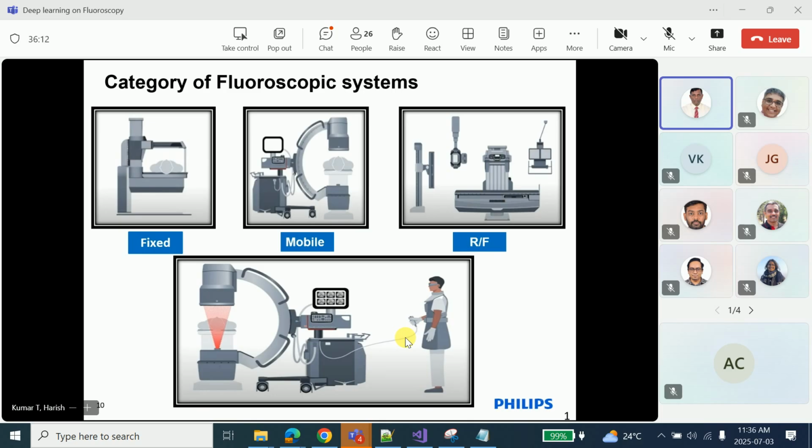What we deal in at DXR is the Proxy system and a Combi system, a fixed system, which is also an RF system, a radiography and fluoroscopic system. We don't deal with the C-arm. Pardon? We don't. That's IGT. IGT takes care of it.